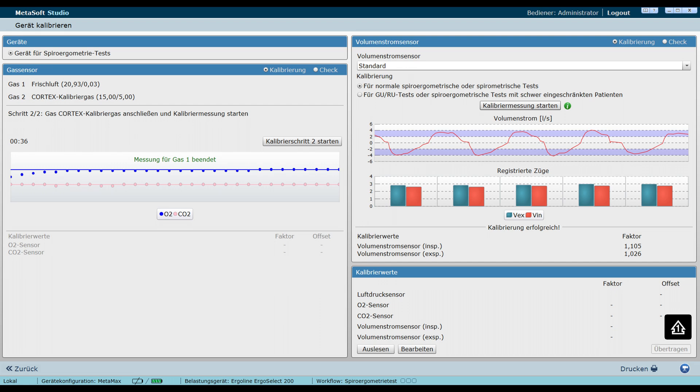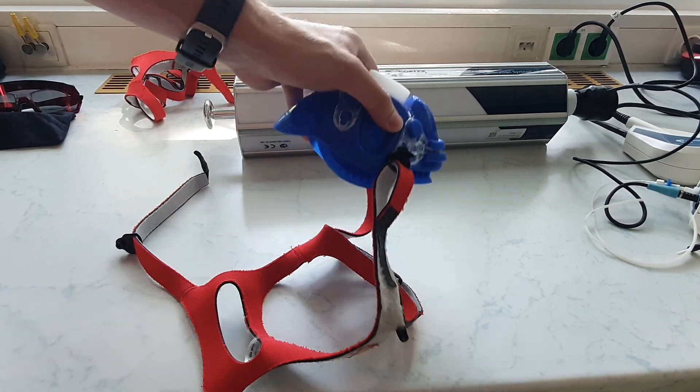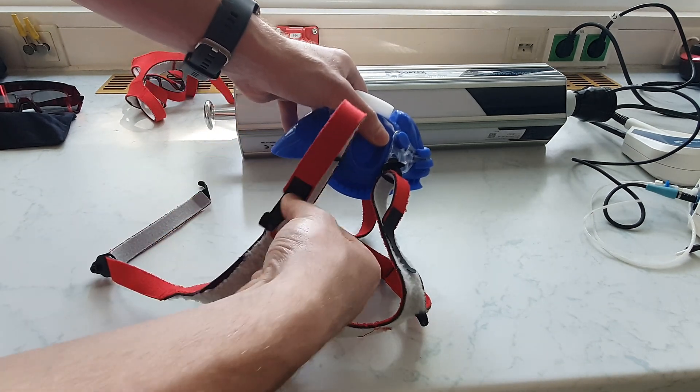Calibration should also take place regularly with the help of a calibration gas. The masks are available in several sizes; the size is selected with the help of the leak test. The spider is now attached to the selected mask, with the red side on the inside.